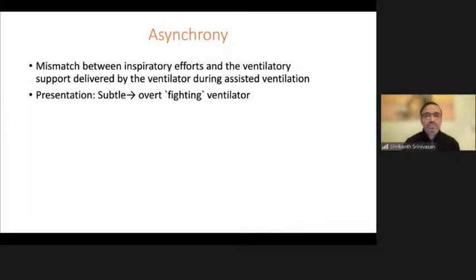So starting with the basic question, what is asynchrony? Asynchrony is a mismatch between inspiratory effort and the ventilatory support delivered by the ventilator during assisted ventilation. The ventilator is a machine. Obviously, whenever the patient triggers it, it will deliver the breath. If there are inappropriate settings which are not adequate for the patient, or the patient's requirement is much more than what the ventilator is delivering, then there will be some form of asynchrony.